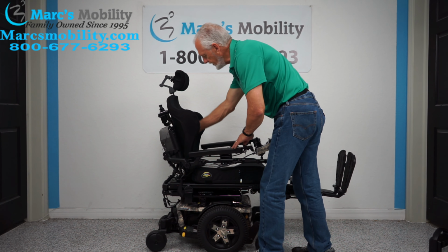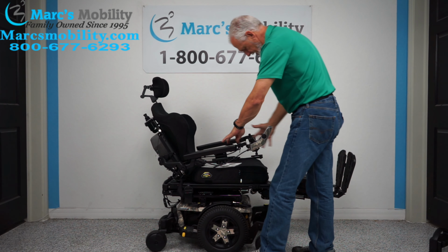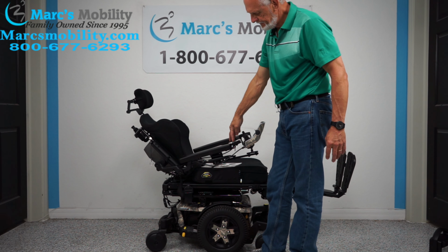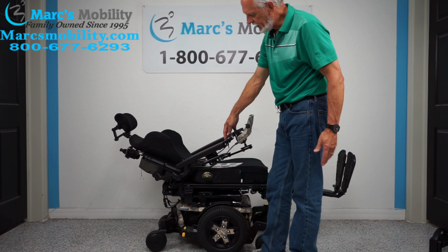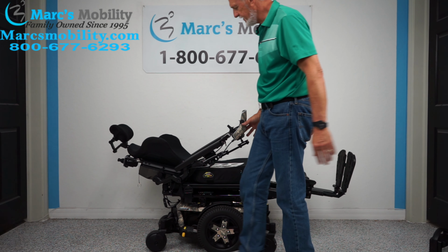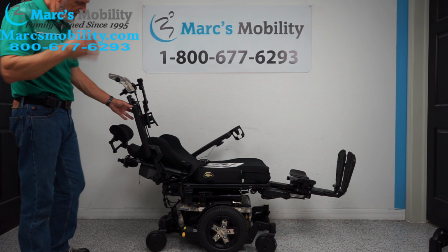The electric recline is when the back right here goes back. Only this portion is moving. Nothing else on the chair is moving but the back reclining. And I'm going to go as far as it'll go. Some of them go all the way, some stop at halfway, some are 3/4. So this is what it looks like. This is as far as it'll go. If you're laying in this chair, that's what it would look like.